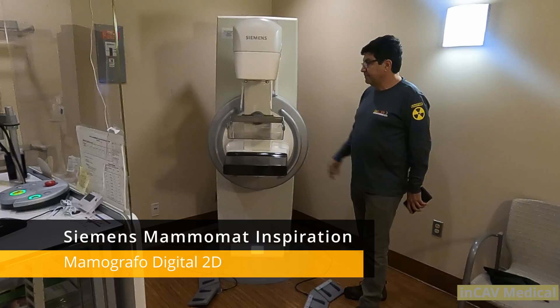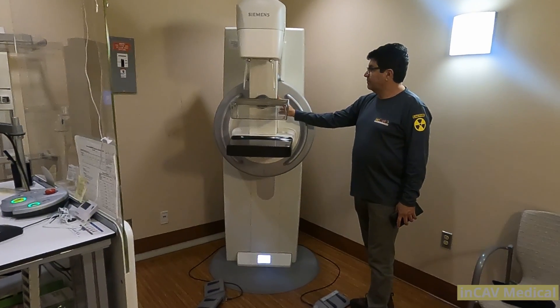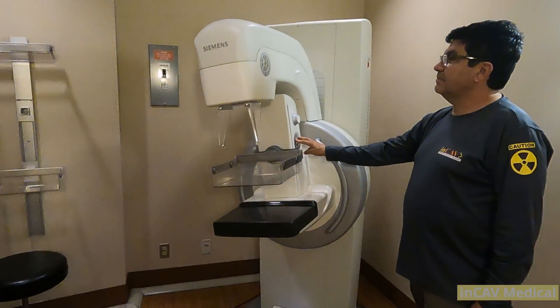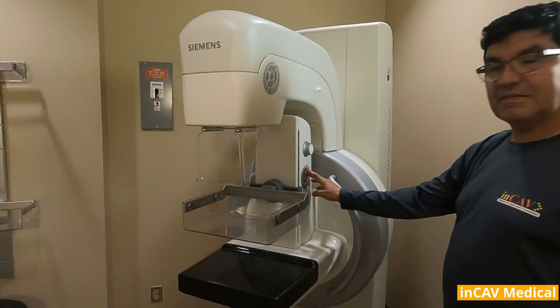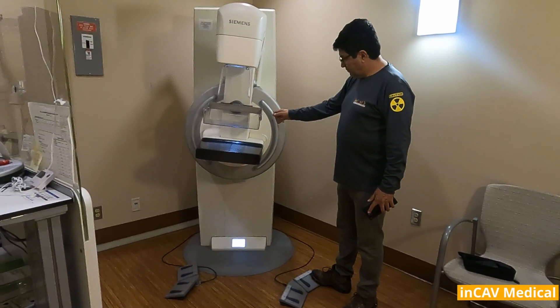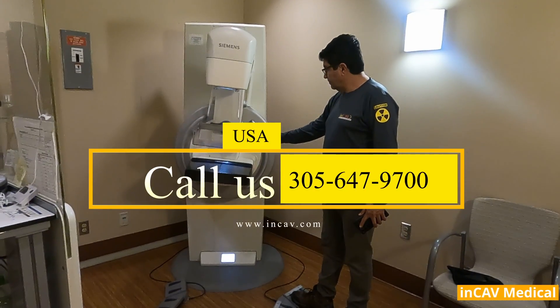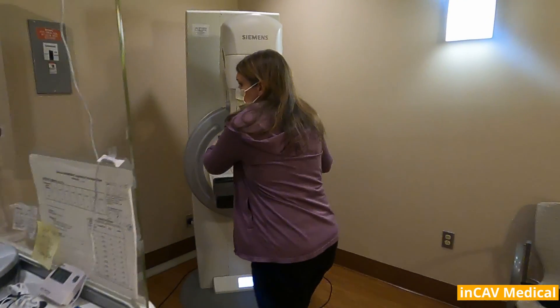On the side of the gantry you will see the controls to operate the gantry and the paddles. This control is on both sides of the gantry — you will see it in the top and the middle part. Also we have the foot pedal; with the foot pedal we can raise up and down the gantry or raise and lower the paddles. We have dual control so you can operate the gantry from both sides.